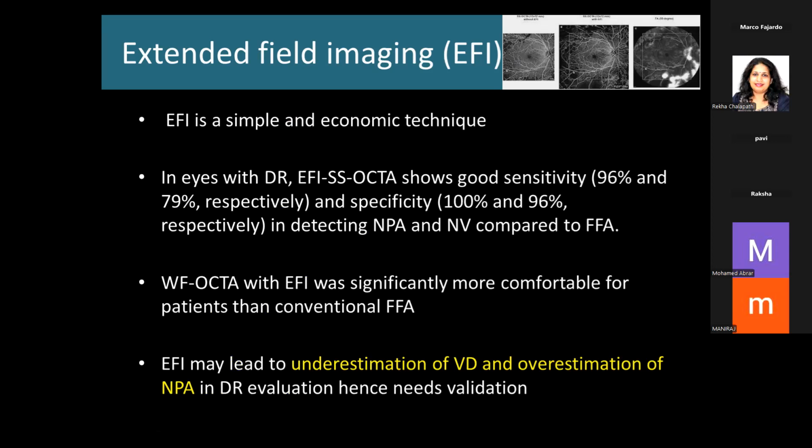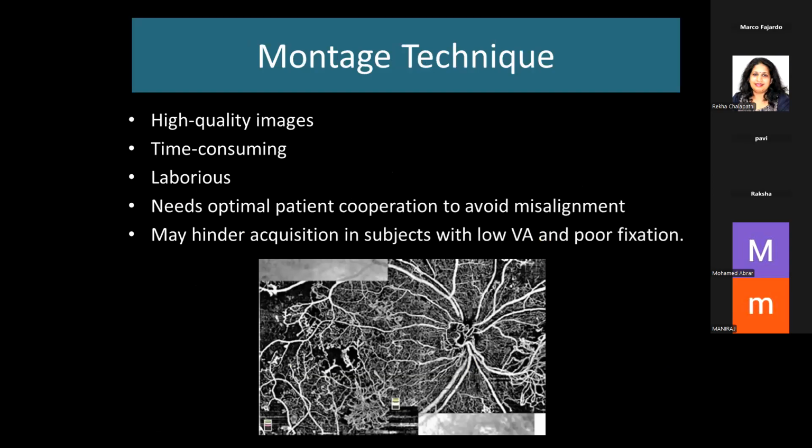The montage, of course, is time consuming. You have to overlap the images, it needs optimal cooperation, and you must avoid misalignment of the vessels. You need to align them properly, and it's a time consuming procedure. The best would be to get a single shot image.